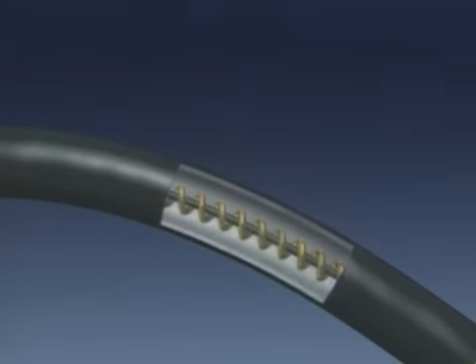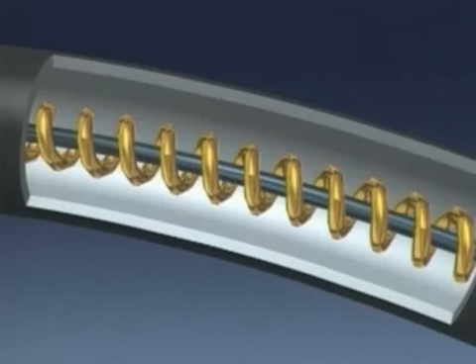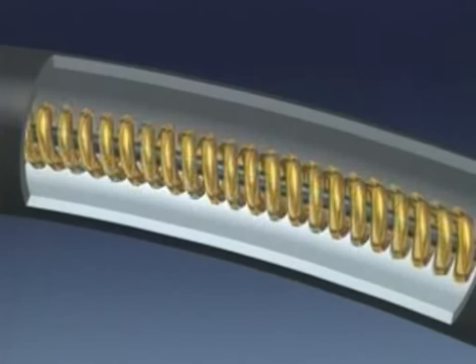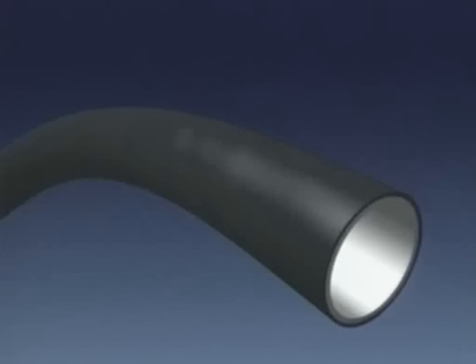Inside the scope there's a stiffener coil and pull wire. Turning the stiffness control tightens the pull wire, compressing the coil and stiffening the insertion tube. The last 30cm to the tip stays unchanged and floppy at all times.